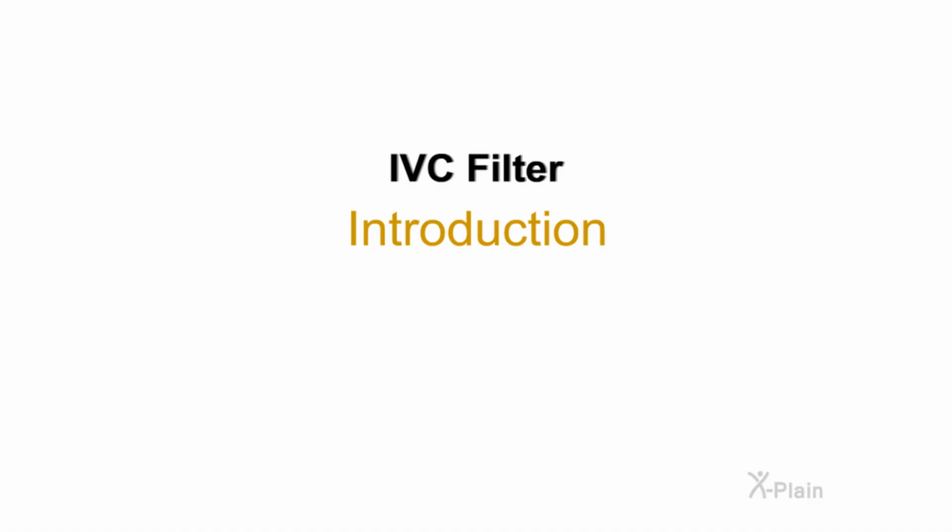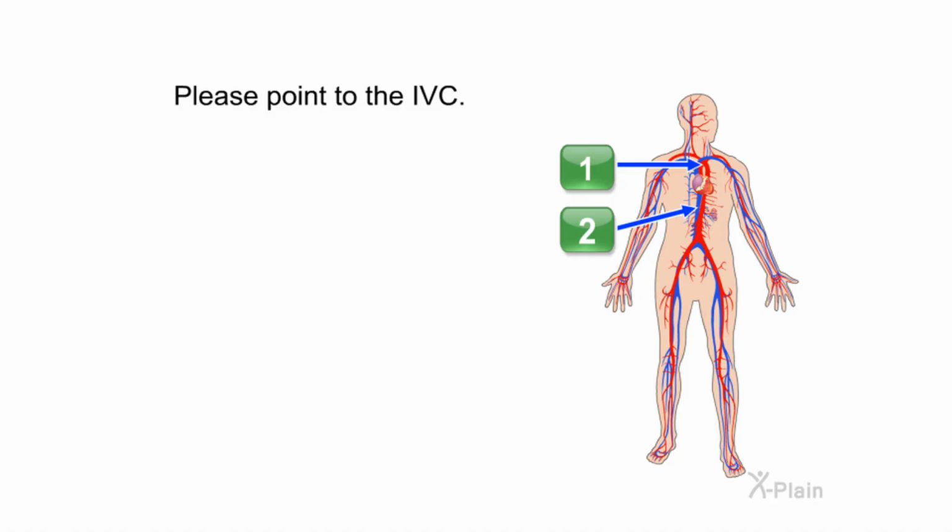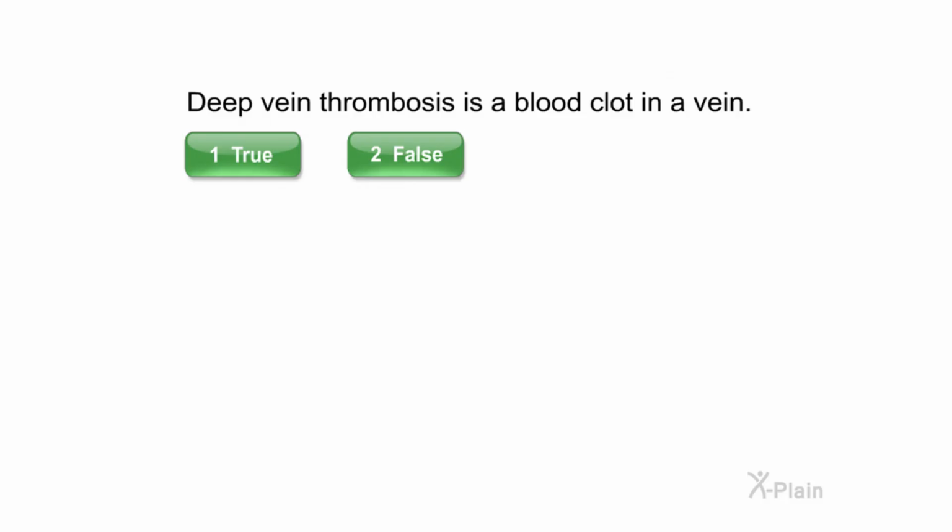IVC Filter. Introduction. Please point to the IVC. Choose one of the following options. Correct. Deep vein thrombosis is a blood clot in a vein.